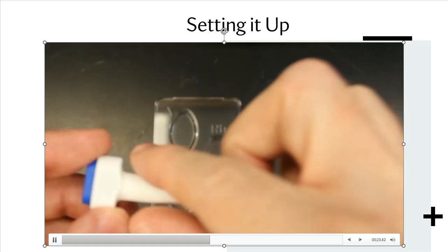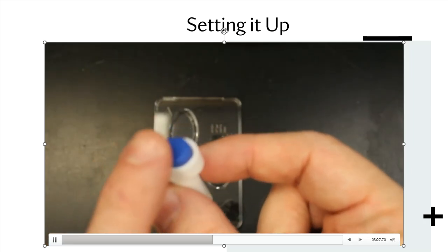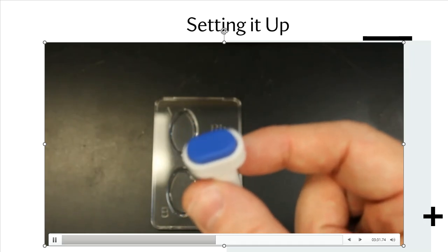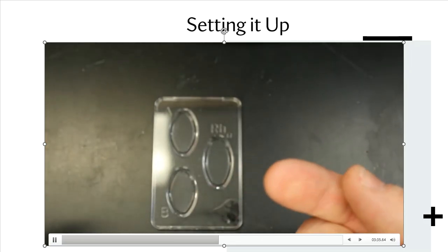It's spring activated. It's ready to go. And up here on the top of this lancet, you're going to find a big blue button. That big blue button is what's going to activate the needle tip, and it's going to poke your finger, and then you're going to get some blood.